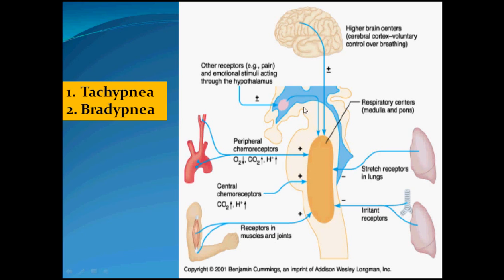Pain is sometimes associated with tachypnea, and in this case, you have to give some sort of analgesia or sedation to the patient. Another important cause is central, and this may be Cheyne-Stokes respiration. Sometimes a patient with head trauma develops severe tachypnea. In this case, you put him on the ventilator with muscle relaxant or heavy sedation, because this tachypnea will be associated with washout of carbon dioxide, resulting in cerebral vasoconstriction, and the patient might kill himself. You have to adjust the minute volume to keep the carbon dioxide around 30 to 35 in order to protect the brain.